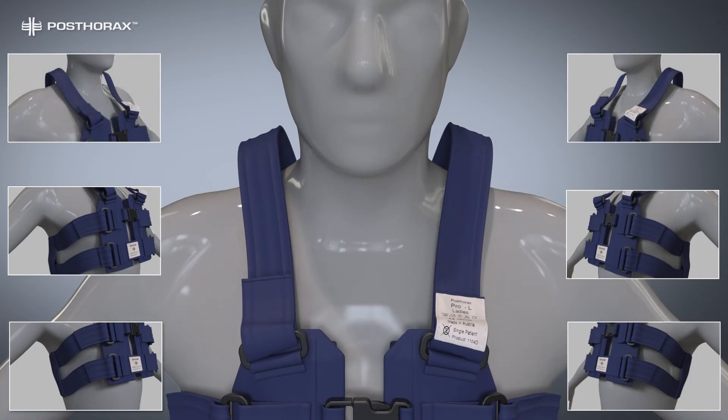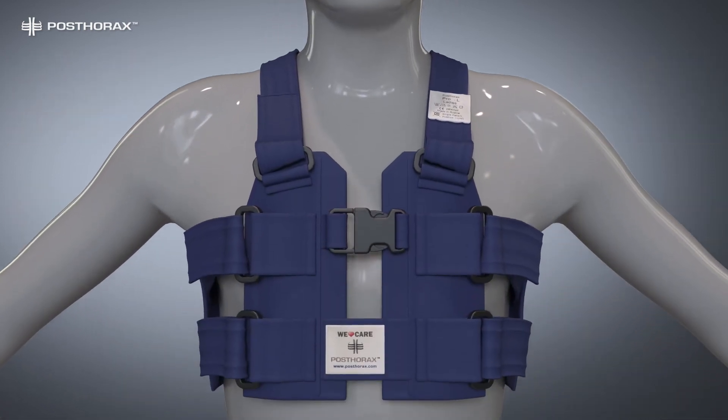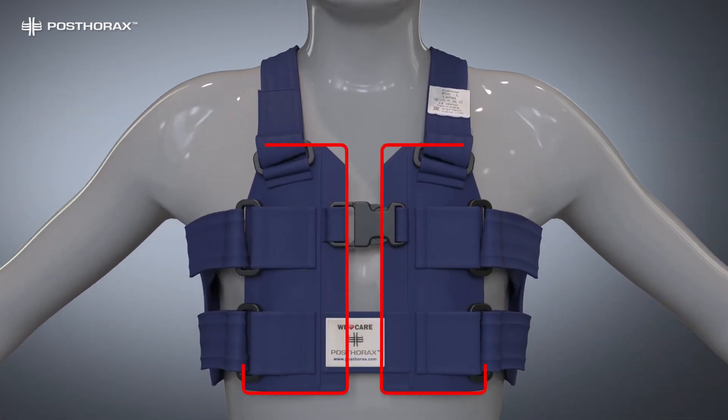Finally, close the shoulder straps, applying a slight pressure on the top of the cushions. Make sure the front cushions are square to the chest. Adjust if they are slightly off.